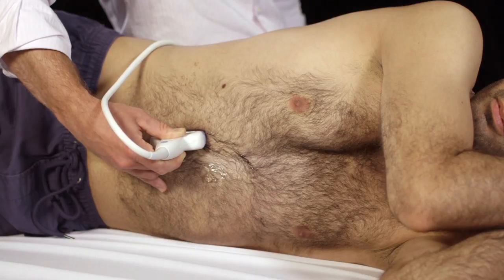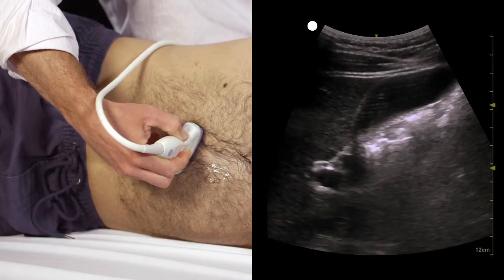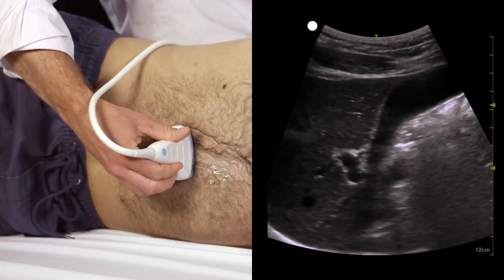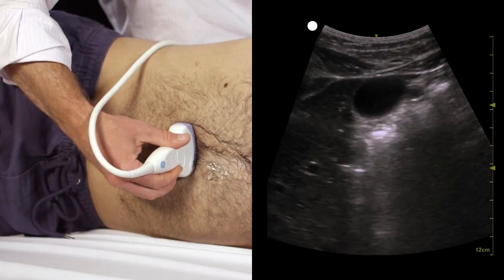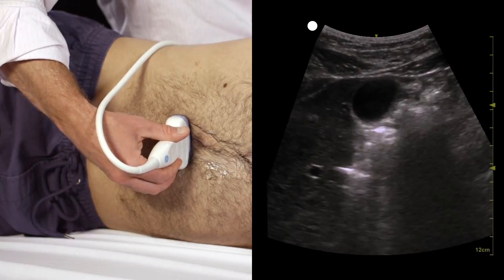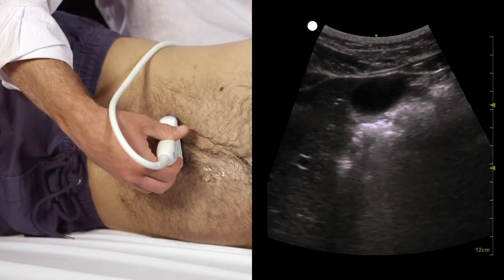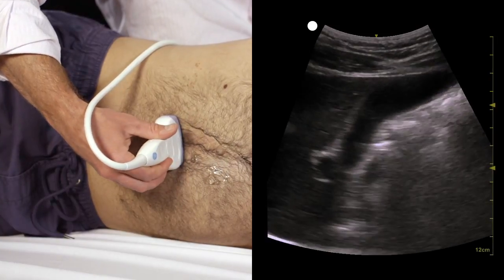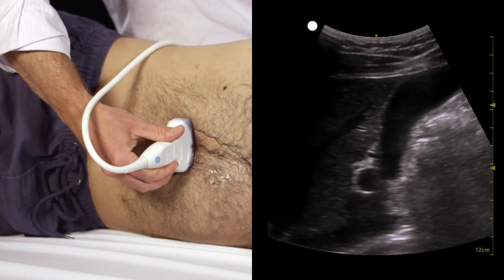Next, sweep through the gallbladder. Then rotate your probe 90 degrees to view the gallbladder in its short axis and sweep once more. Ensure you visualize all the way down to the neck of the gallbladder. Keep on the lookout for stones. Gallstones will appear as bright, echogenic round structures with a dark acoustic shadow below them.